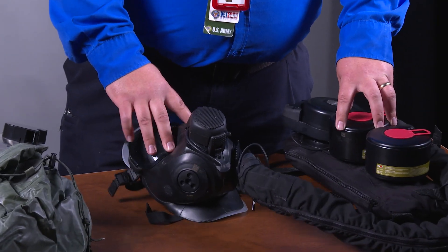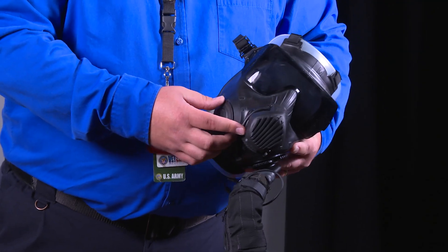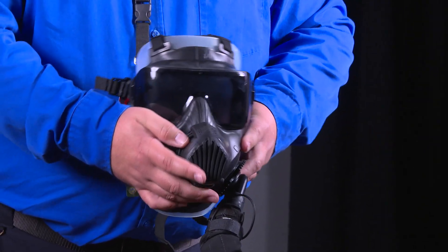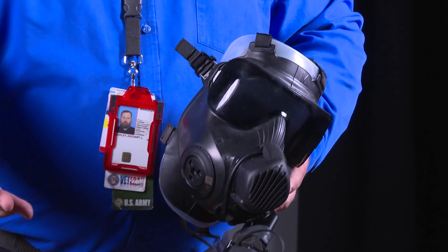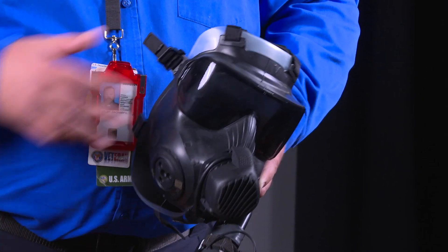The MPPAPR has a voice-transmitter device, which allows for clear audio communication from the wearer to a group of people, without needing to be as close to be understood as with the Sentinel XL.